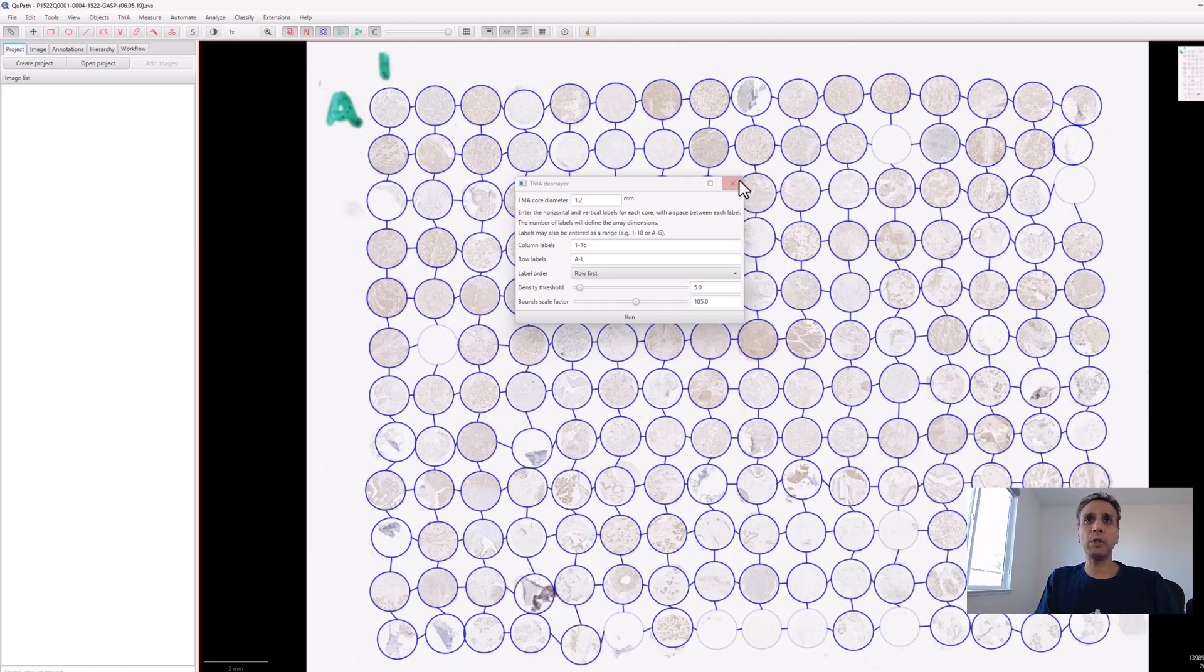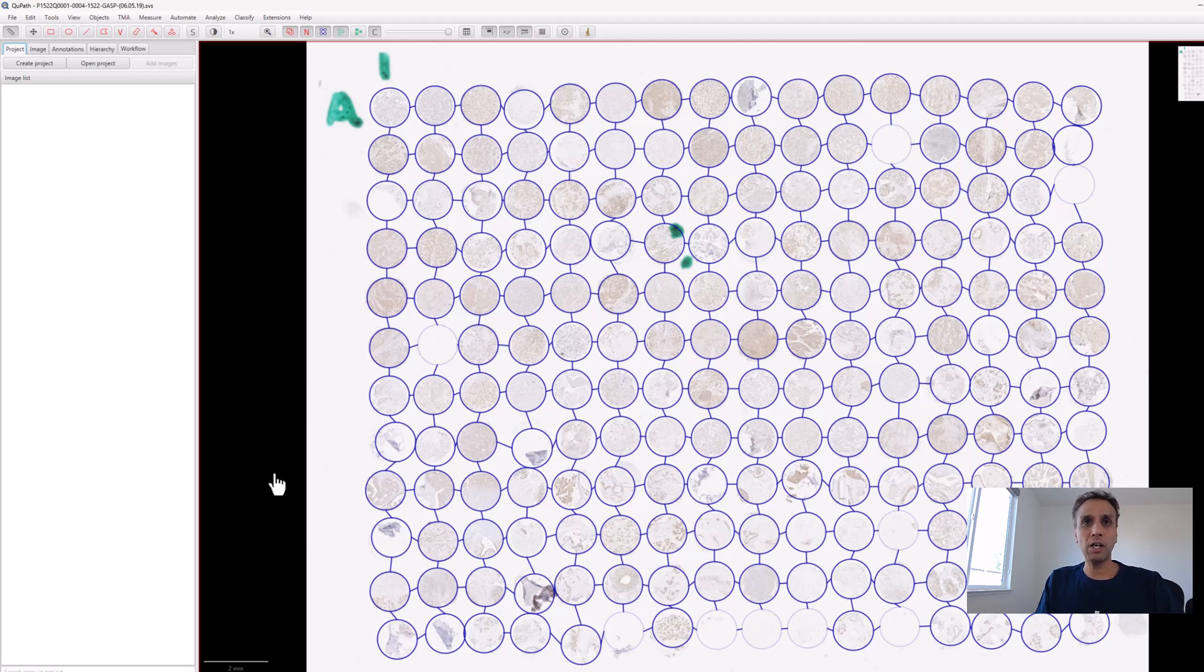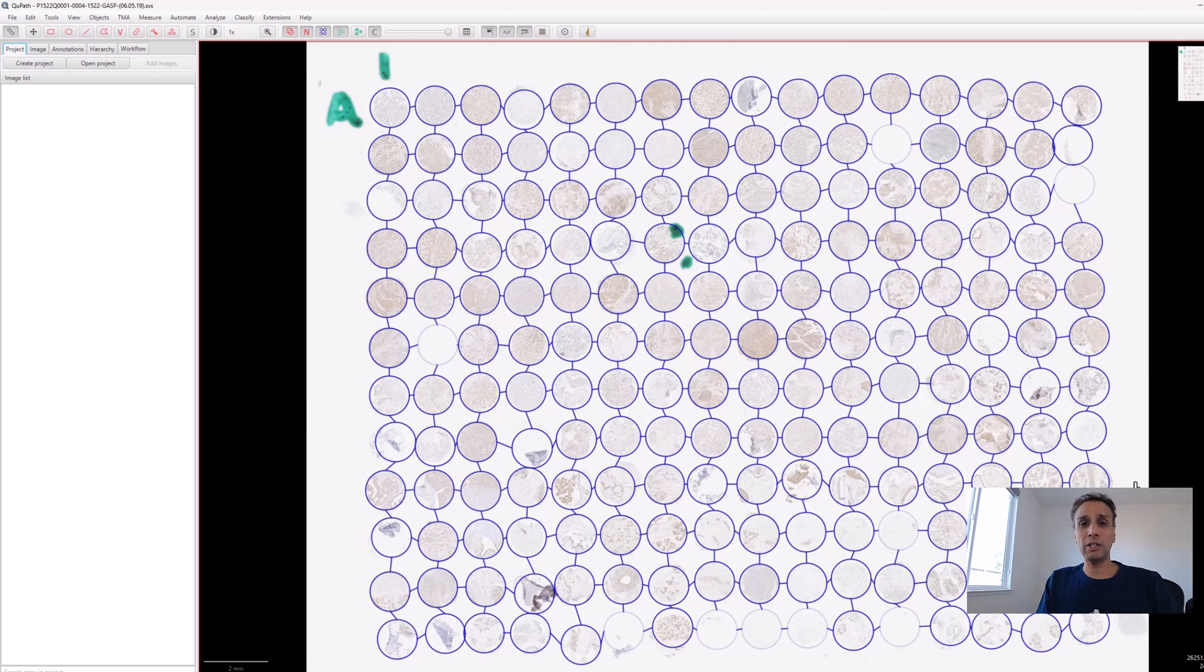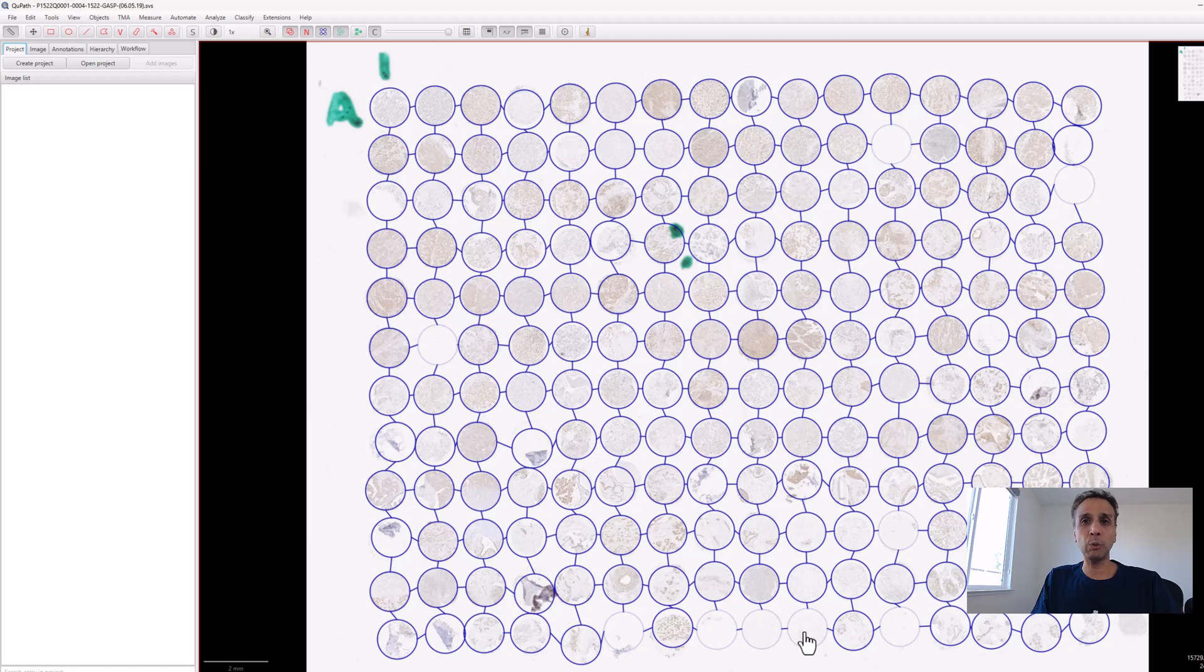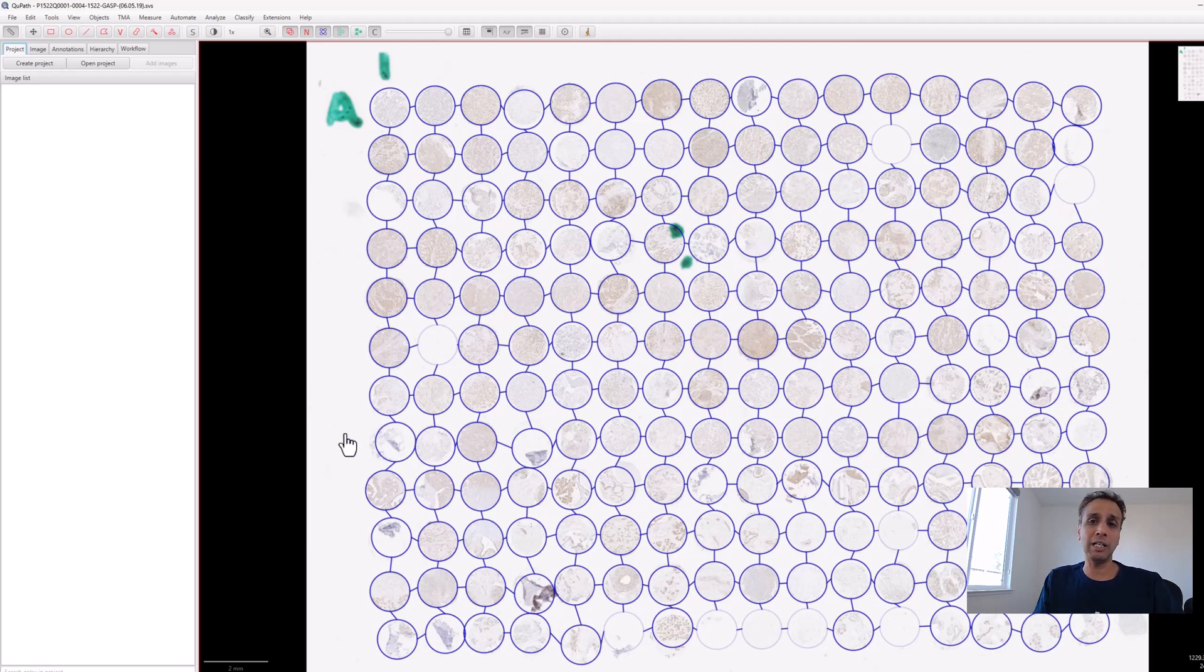This is exactly why I'm using QuPath. I tried coding this in Python using cluster algorithms, but couldn't do a good job detecting all cores. It worked okay with good contrast, but if you don't have good contrast even QuPath struggles. But QuPath is very visual—you can add or remove cores. Otherwise you can easily code it in Python if the contrast is good.